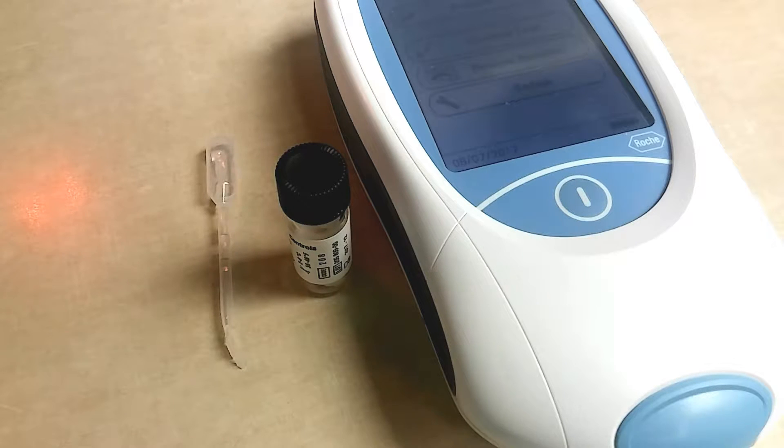Hey guys, it's Mara and today I want to show you how to run quality control and give you an idea of how to run a patient on the Coaguchek XS Plus.